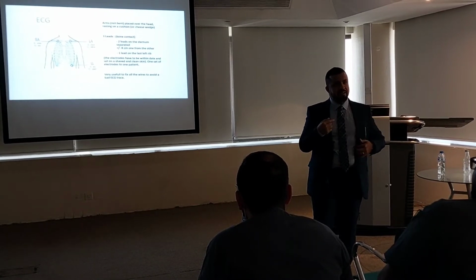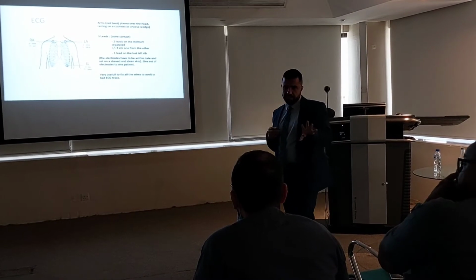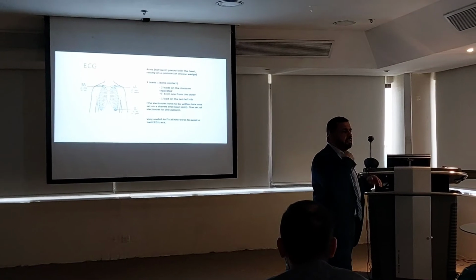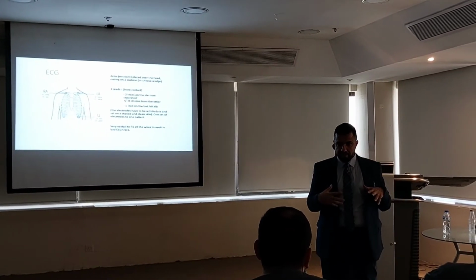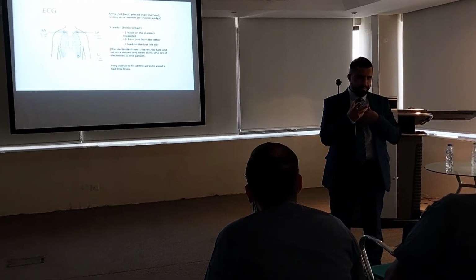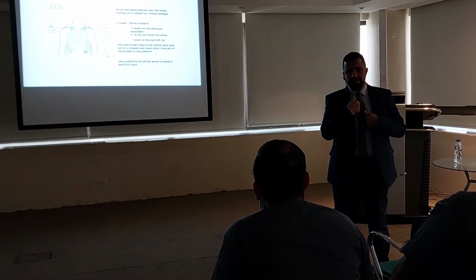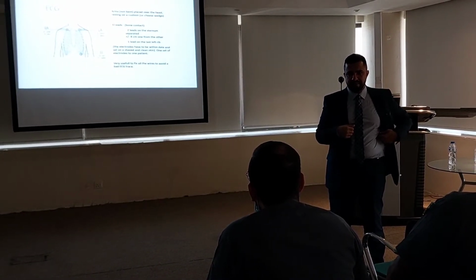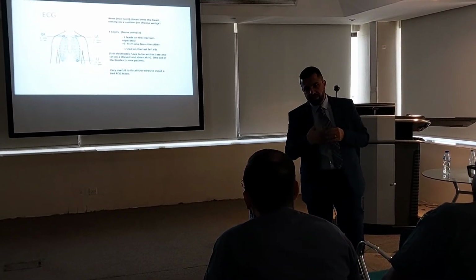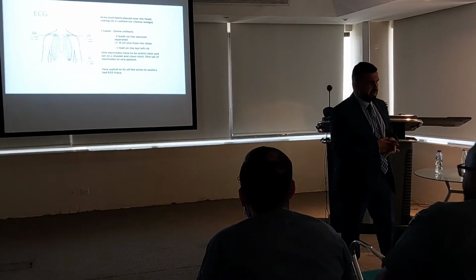Okay? And the last one: if it's not giving you a good signal, mostly this will work perfectly, but in a few cases you may need to consider other positions. From my personal experience, if it's not working, I will use the upper sternum, mid sternum, lower sternum, and left rib as it is. This is very good for females, because there is no hair. Otherwise, for the baby, it needs to be very good.